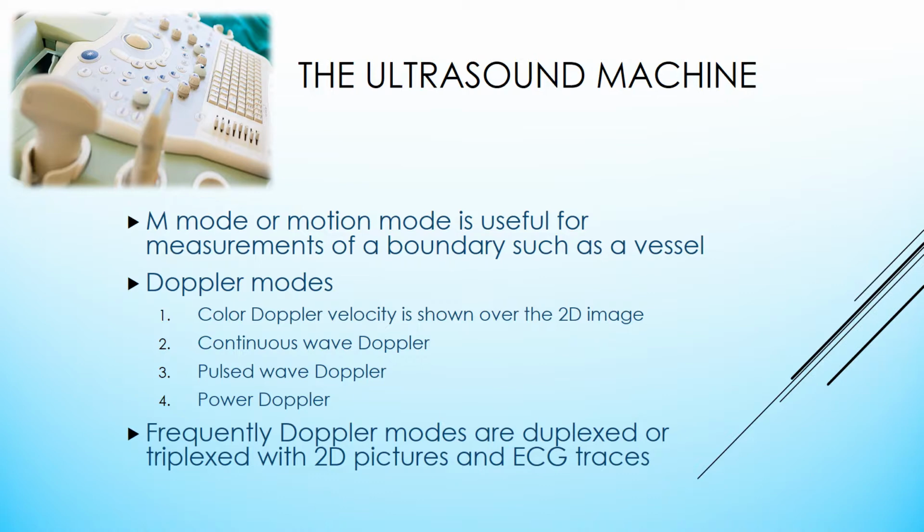Three, we have pulse wave Doppler. This uses only one crystal. It's very useful for clot detection in TEE. Four, we have the power Doppler.